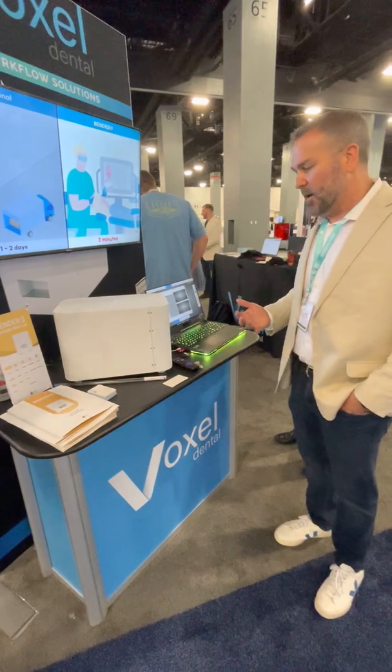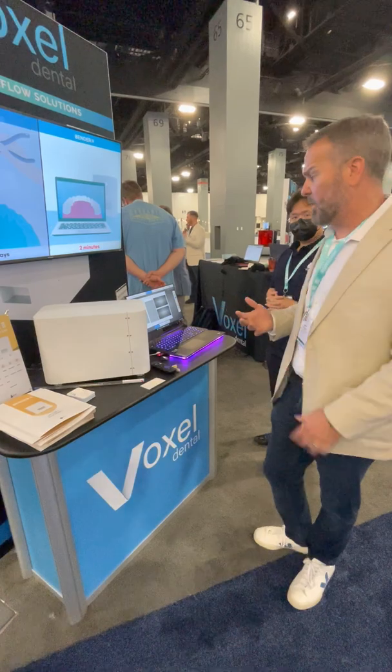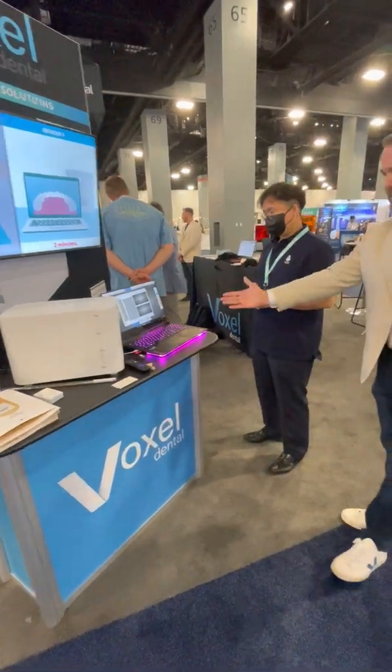It's really just as simple as being chair-side with the patient. You're ready to take the braces off, and you can just take a quick intro scan — upper, lower, both, whatever you want. And then Sergio is actually going to show us how that works.